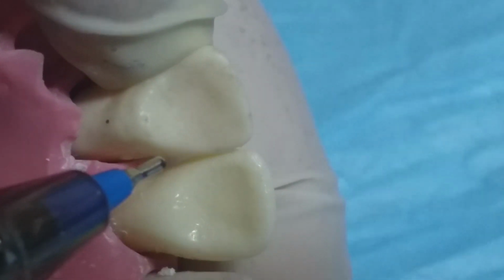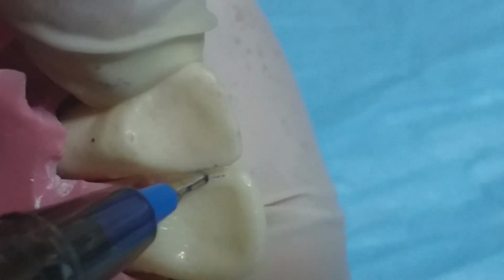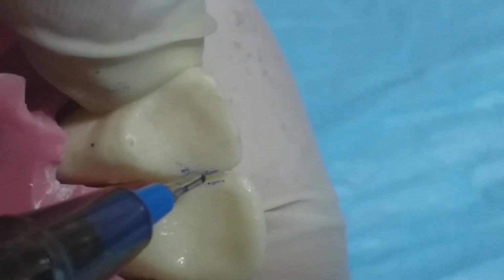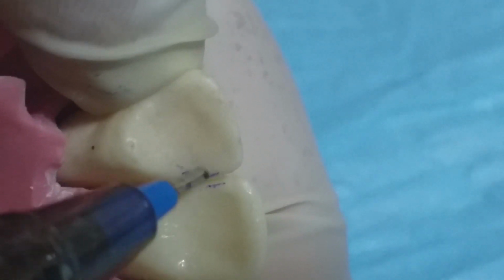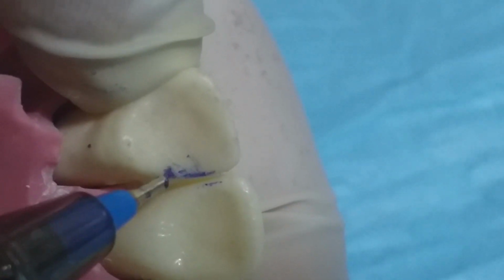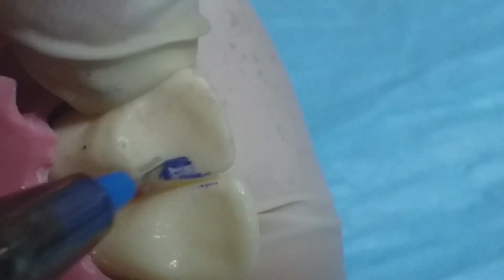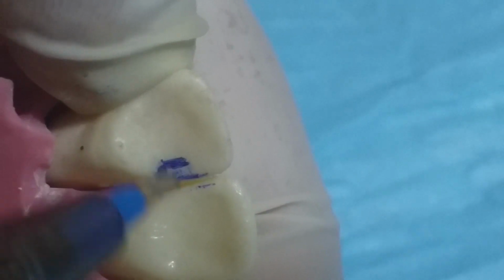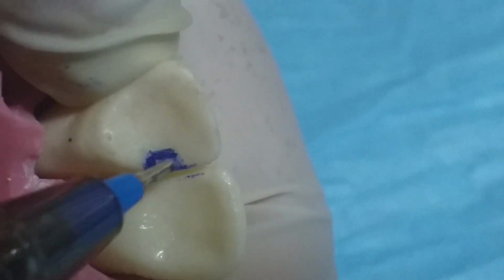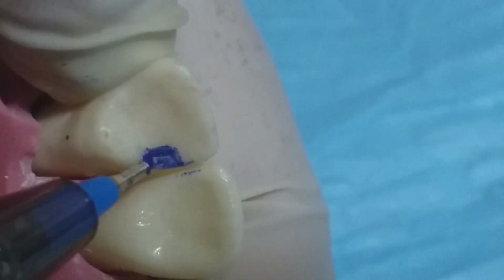Now we will begin to draw the outline, but first we will need to draw the contact line between both teeth. This line has a significance to facilitate drawing the outline of class 3, as you will see now. We will draw a line horizontally extending from half distance of the contact line we drew first, and we will draw below it by 2 milli a gingival line, horizontally also, resembling the gingival wall, and the first line we drew horizontally is resembling the incisal wall of our outline of class 3 preparation.